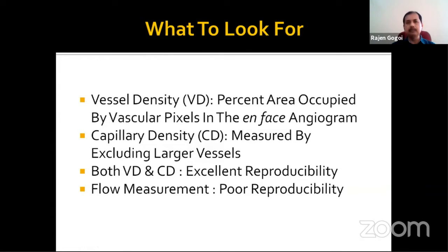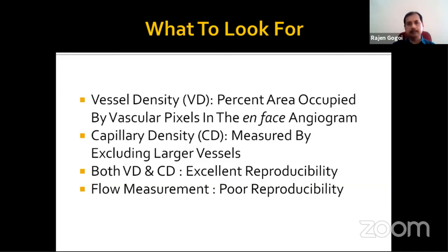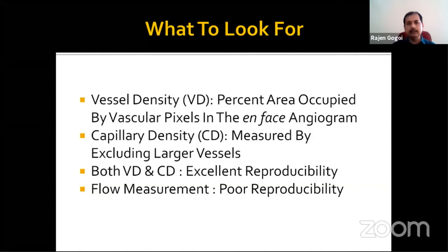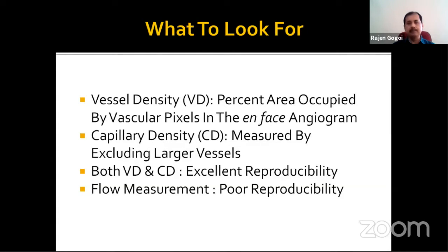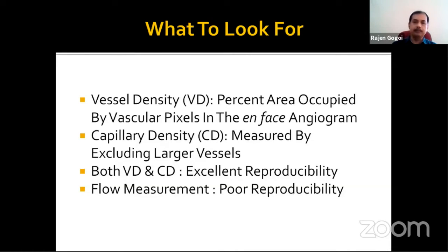What should we look for in OCT angiography? Ideally, two things: vessel density and capillary density. Vessel density is the percent area occupied by the vascular pixels in the en-face angiogram. Capillary density can be measured by excluding the larger vessels. Both vessel density and capillary density have excellent reproducibility, and that is how OCT angiography scores over other tools. Blood flow measurement is also possible with OCT angiography, but it has poor reproducibility, so we should prefer vessel density and capillary density.